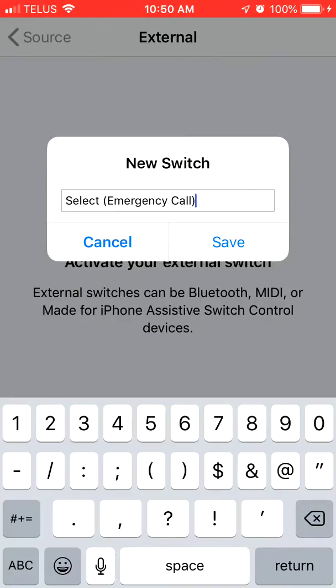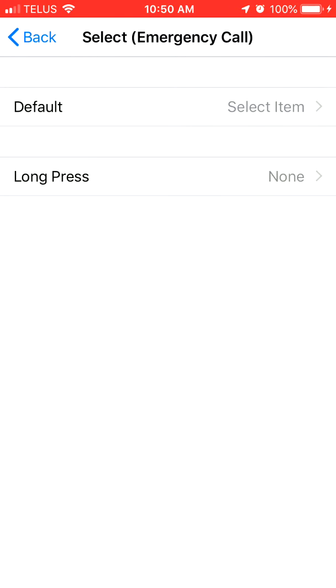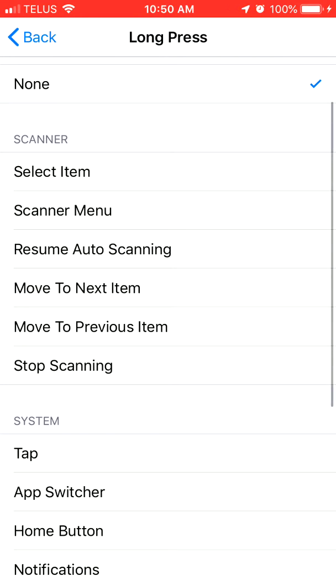You'll notice that the button labels are referenced to their alternative functions. For example, the alternative function of the upper left button was to make a text message, hence T. The button in the upper right was to make a video call to Be My Eyes app, hence the V. And the button in the middle, the alternative function, is to make a call, hence the C. So we're going to click Save, and we're going to assign as the action, Select Item. And for long press, we are also going to assign another function, in this case, App Switcher.